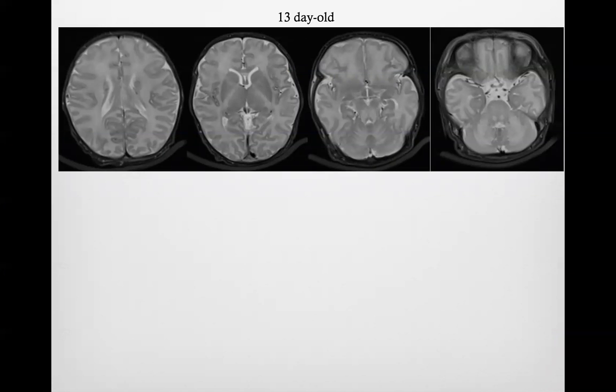Now, when the child is just born, basically the child has an unmyelinated brain, but there are some parts of the brain, the central part of the brain, that should be myelinated, in particular the posterior limb of the internal capsule, already myelinated at birth, and the posterior fossa structures. But because these are myelinated, these are extremely active areas, and this is why these areas are susceptible to acute damage if something goes wrong.